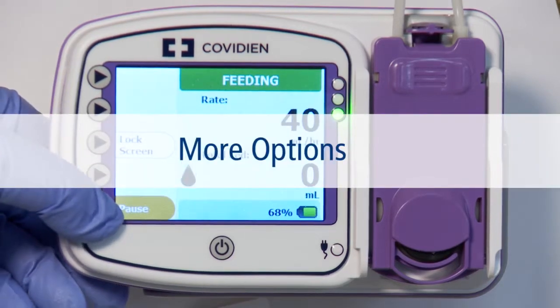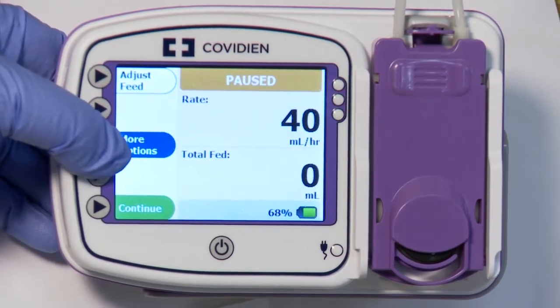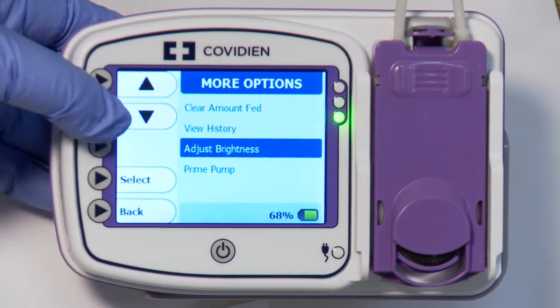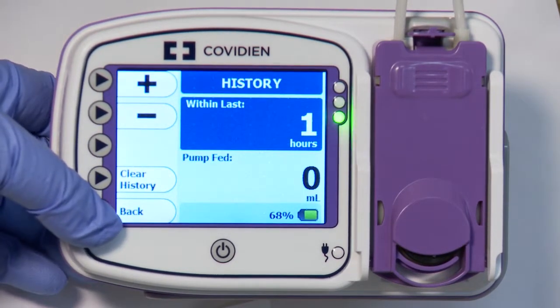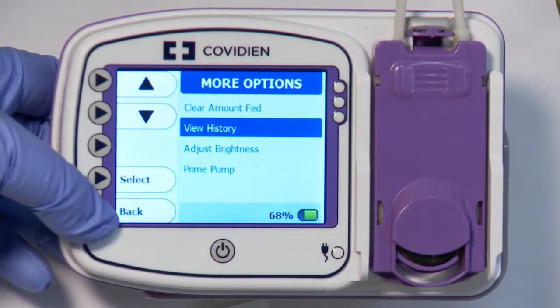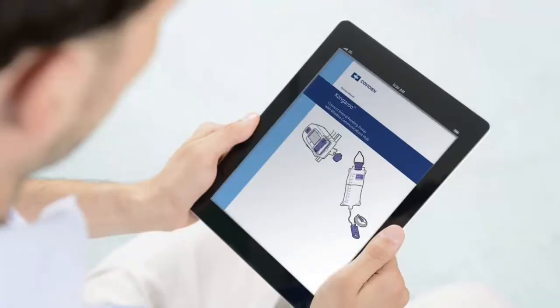More options. To access the features of Clear Amount Fed, Airplane Mode, View History, Adjust Brightness, or to reprime the pump, press the More Options button. Use the arrow keys to highlight the feature you want to activate. Once highlighted, press the Select button to activate the highlighted feature. A check mark should appear next to the feature. Press the back button, then continue to resume feeding. Additional information is available in your operator's manual.